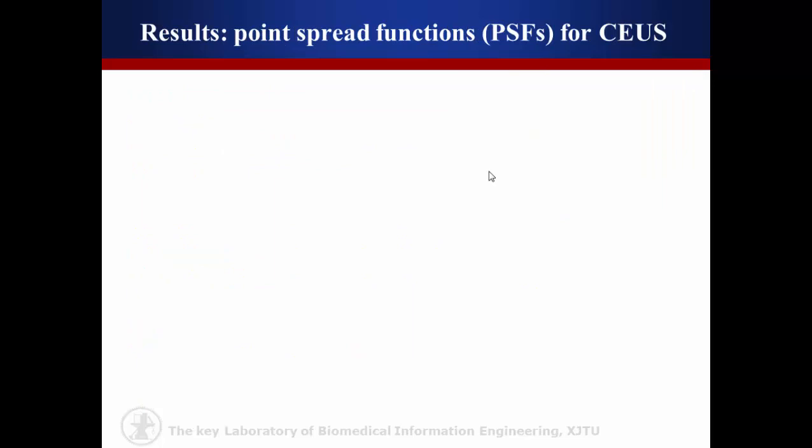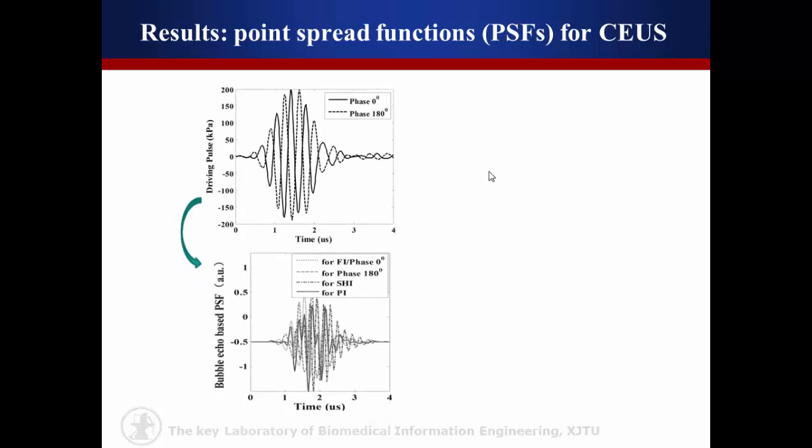Let's move on to the results. Firstly, point spread functions for CEUS were estimated. From the driving pulses, bubble echo-based PSF were constructed. Note that the waveform for phase 0 degree and phase 180 degree also acted as bubble wavelet in PIWI.